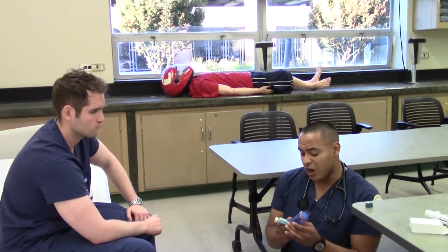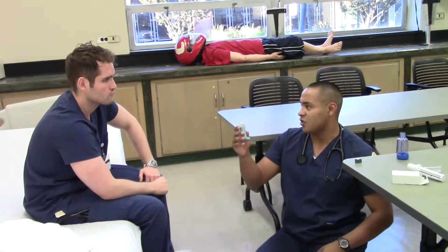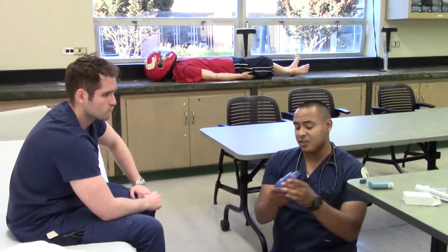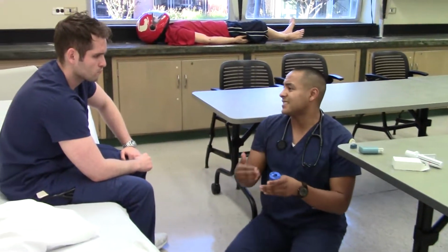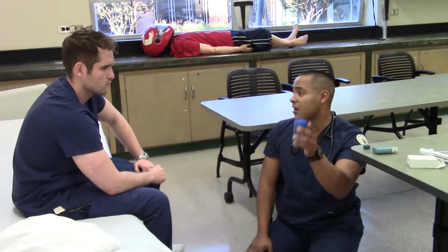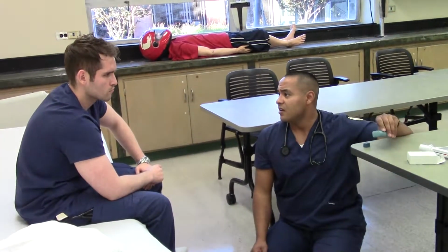When you wash both of these, you want to just use warm water and soap, and just let it air dry. This here, same thing, water and soap, but this you don't want to clean the inside. It creates like a static and it attracts the medication inside. So just let it air dry, no rub. Well, yeah, this one you can just clean and whatever.